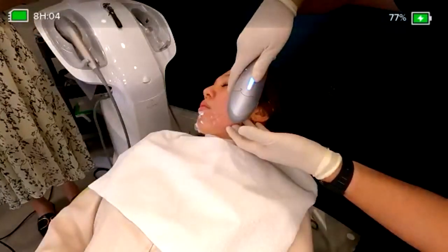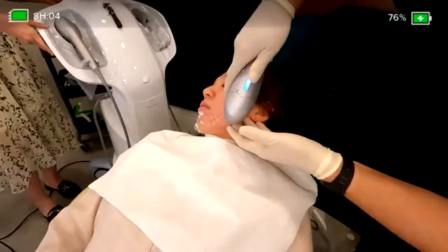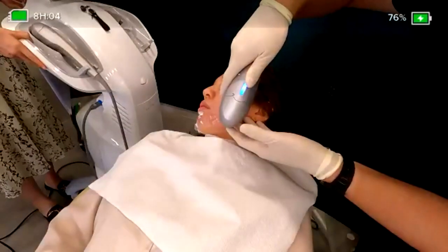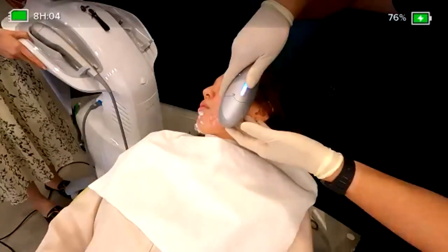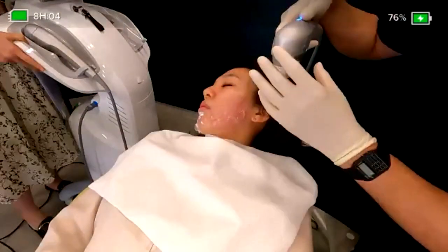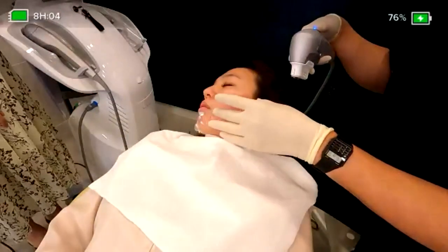You can see the blinking lights, maybe you cannot hear the sounds properly, but you can see a vertical movement up on the face. But sometimes if we are checking the count shots properly, usually we are going that way, calculating all the way down before we treat, the measurement of how far we go.